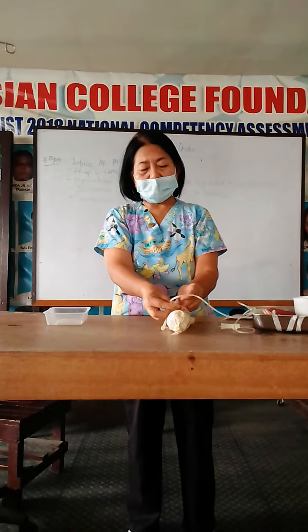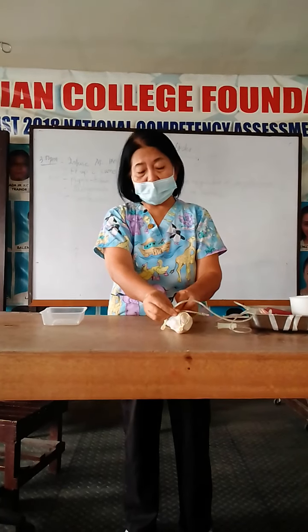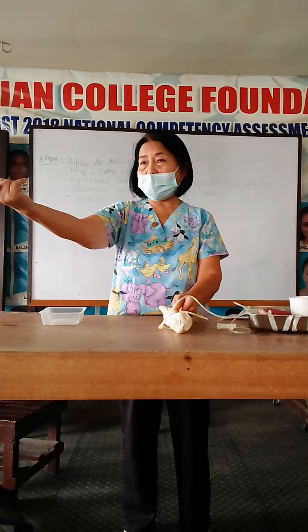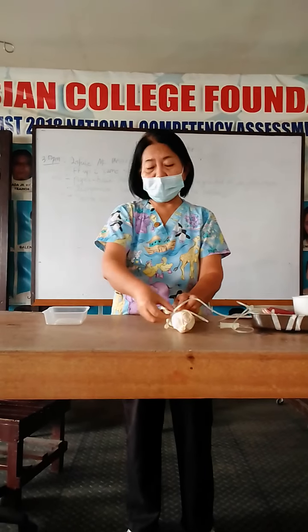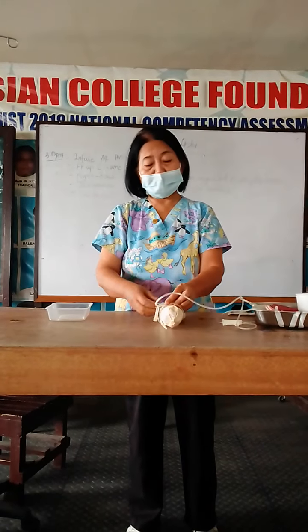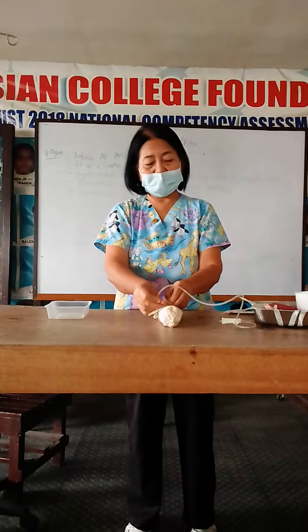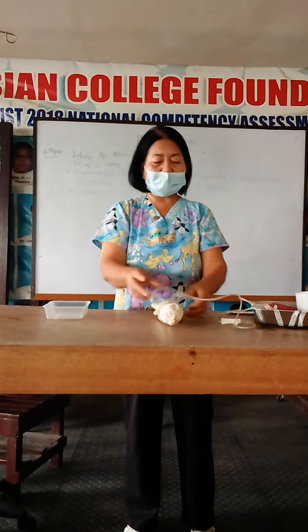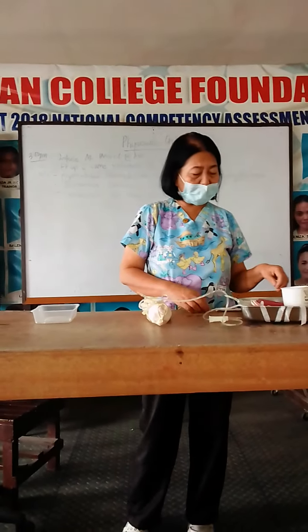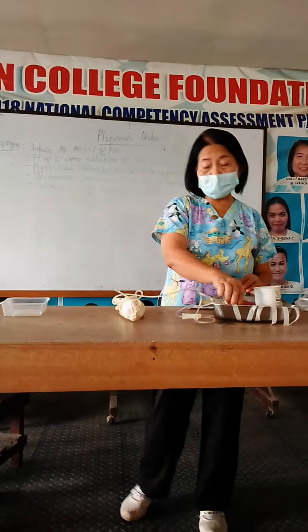Then, when you already tied it, that's the time you release the fingers. It should be the one directly on the skin. Otherwise, again, the skin will tear. Because the elderly has poor skin turgor because it has no more collagen. Collagen and fat. Okay, I can do it. So, I'm going now to insert my needle. So, again, check the packaging of the needle.